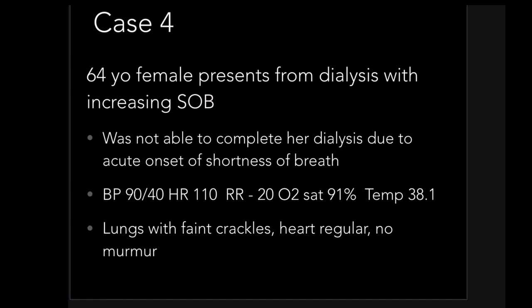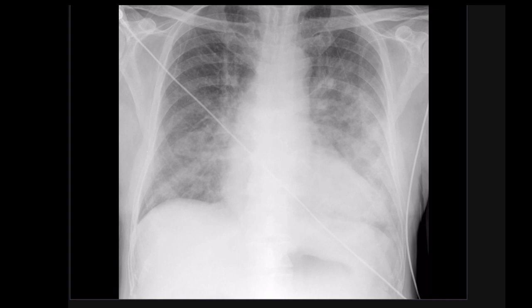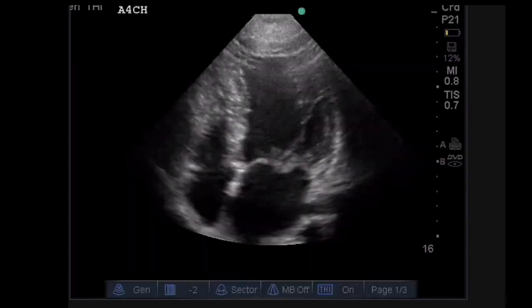For a final basic case: 64-year-old dialysis patient presents hypotensive with shortness of breath. Going through the algorithm — no big effusion, LV function looks okay. Effusion and function both look pretty good. Relative chamber size: the left atrium looks big. If the LA is big but the LV is functioning fine and the right side looks fine, the pathology is most likely at the mitral valve — and if you look at her mitral valve, she has a flail segment.